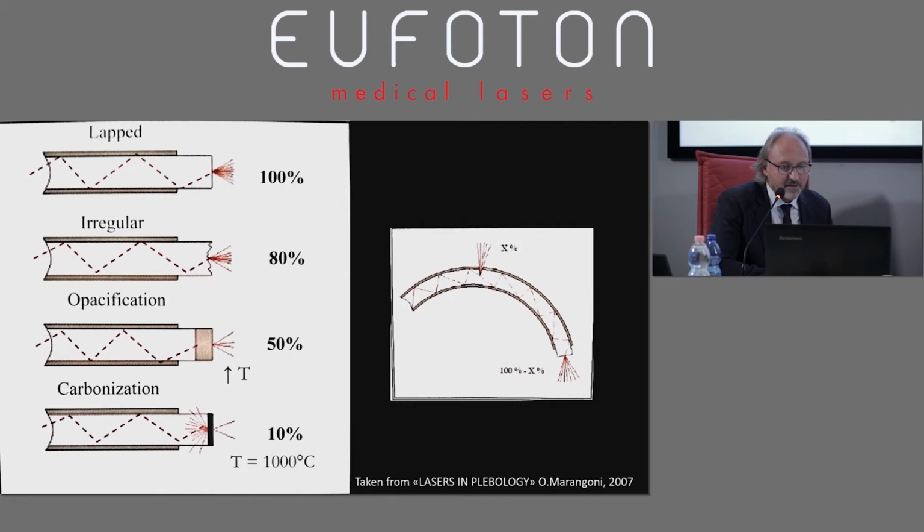The second, deformity, irregular, is due to some wear and tear due to the impact on the tissues. You see more fibrotic tissues with some scarring, and also tissues that have been previously treated with surgery. So the tip of the fiber is worn more quickly, and the tip has to be substituted intra-op. It doesn't slide in so well, no more smoothly.